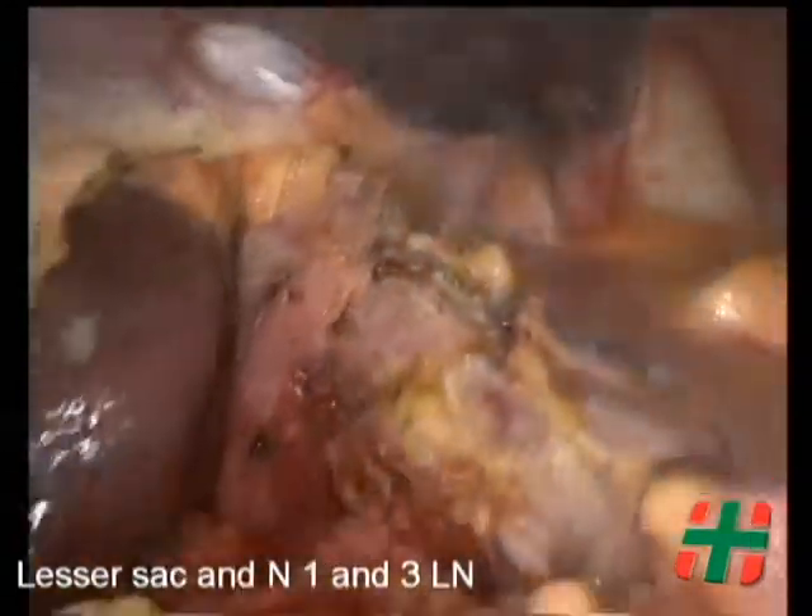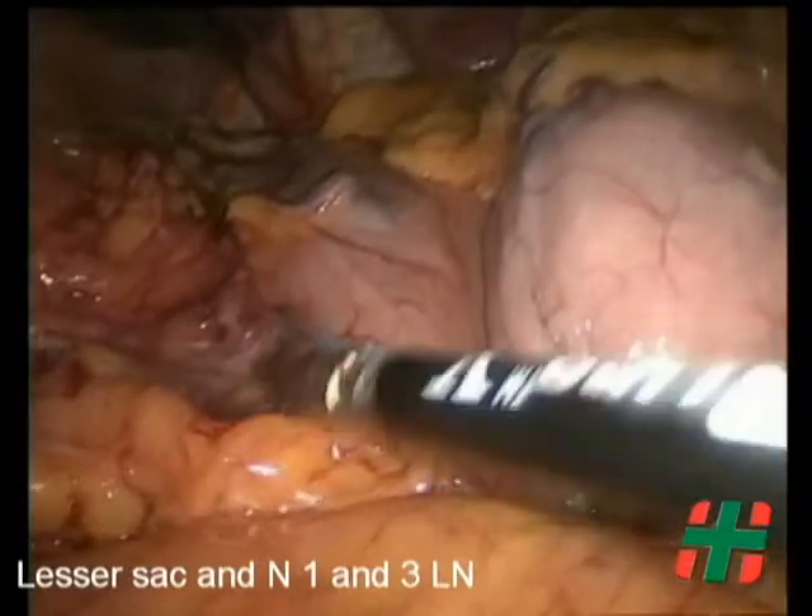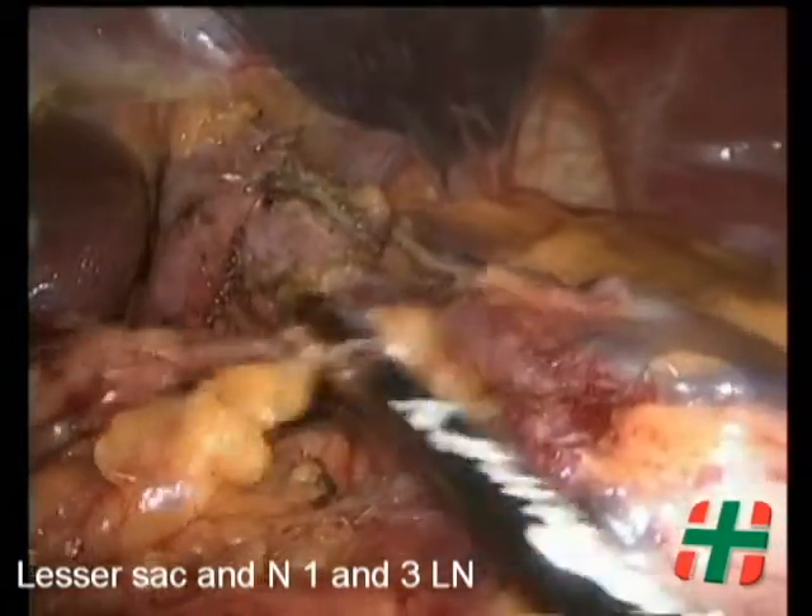Lymphadenectomy continues superiorly, taking nodes in groups number 3 and 1. The right crus is freed from all lymphoglandular tissue.